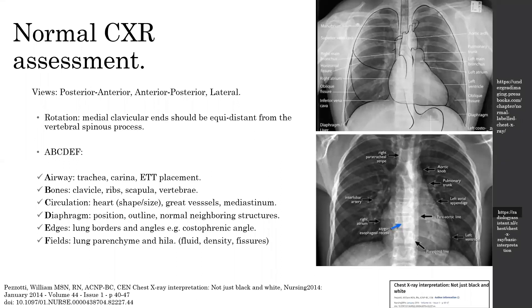For chest x-ray assessment, you should first note the view — whether it's posteroanterior or lateral. After that, you need to assess the rotation by checking the distance between the medial clavicular end and the spinous process in the middle, which should be equal from both sides.